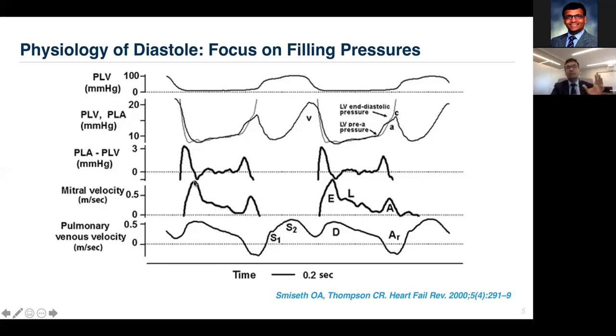And this gives rise to slight differences between the peaking of the E wave and when the blood flow starts decelerating. Notice that the peak of the velocity is happening just after the peak of the gradient, and is only decelerated when the gradient reaches zero and lower.